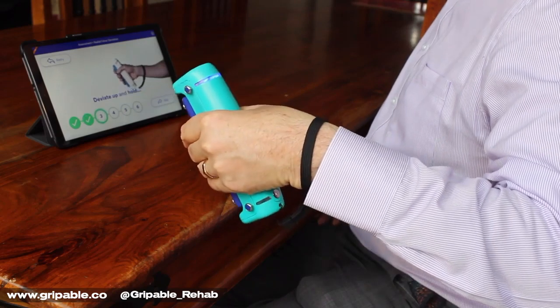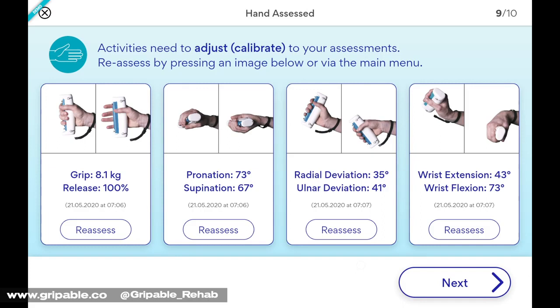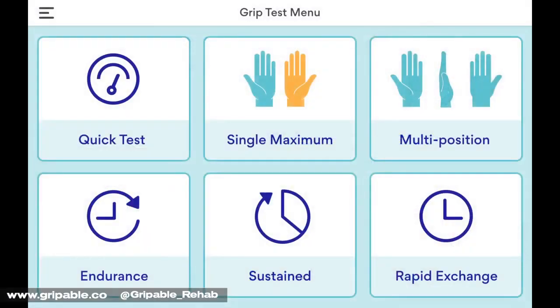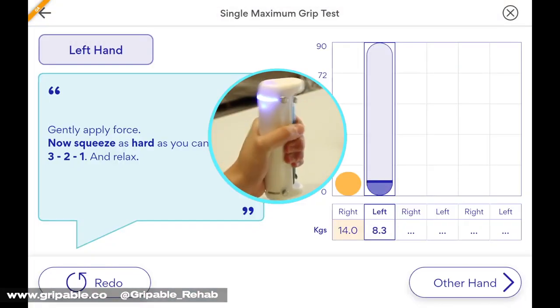Range of movement and grip strength measurement is vital in providing a baseline for treatment and as an outcome measure. Grippable measures movement in three planes. When measuring single maximum grip strength, the therapist can customise the test by choosing the number of repetitions and which hand to start with.